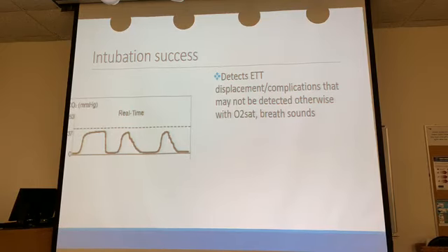So if you got that tube in place and you're going down to Galveston with that patient, you need to be watching the end-tidal CO2, because if all of a sudden you see this, you've got a problem. Your tube's not in place anymore. Something's wrong with it, okay?